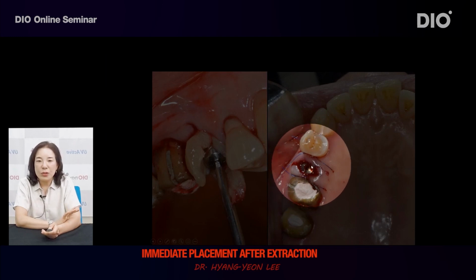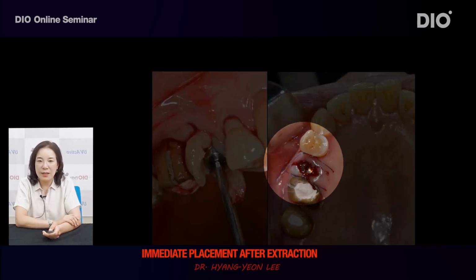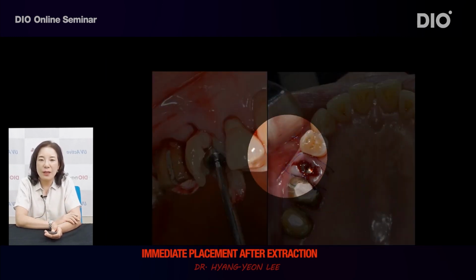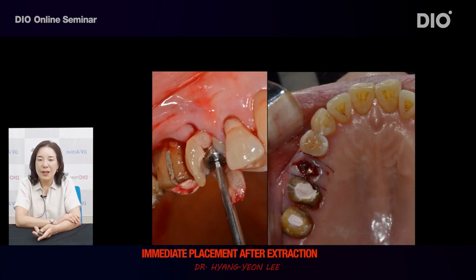What is important is that you need to suture to prevent the bone in this space between the soft tissue and the abutment from leaking out. If this opens, bone between the implant and tooth extraction socket inside will leak out. Therefore, you need to suture to prevent leakage of the bone particles.